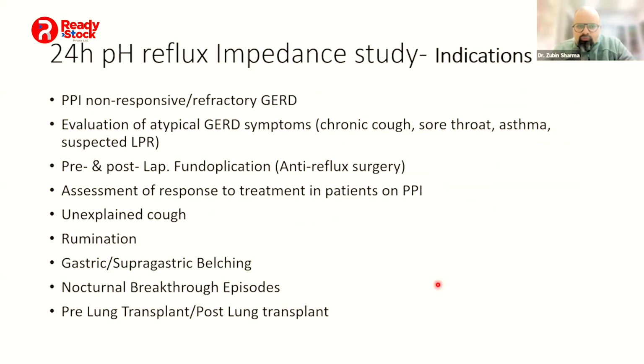Okay. So when will you do it? As I said, once we have covered the basics, when will you do the pH impedance study? Remember all these clinical situations. You have to diagnose GERD, you have to look at the non-responsiveness to PPIs. Why are PPIs not working? Before you label somebody as refractory GERD, and refractory GERD is altogether a different talk.